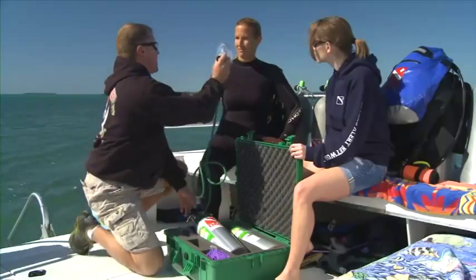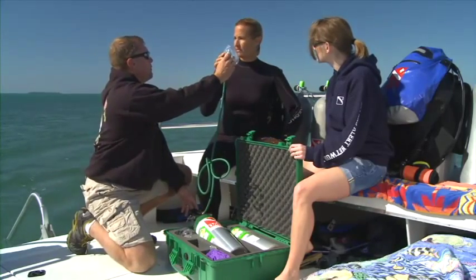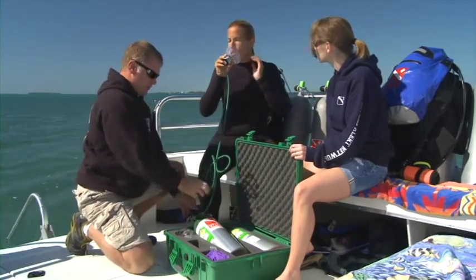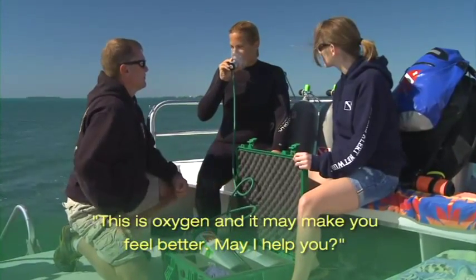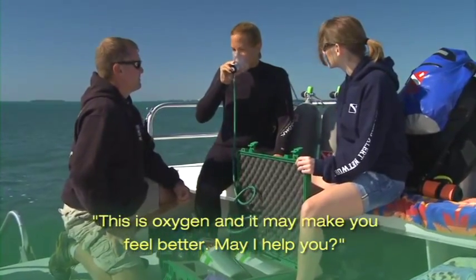Exhale away from the mask to reduce the risk of disease transmission. Inform the injured diver that oxygen may help. State, 'This is oxygen and it may make you feel better. May I help you?'